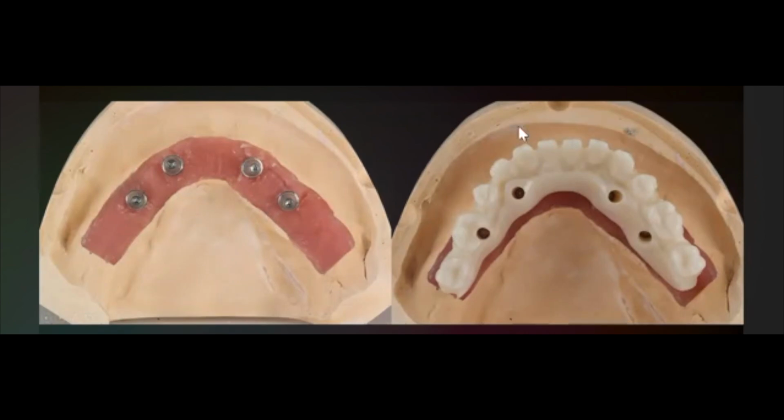So when I designed the case, I saw that it was a big framework. To cast this framework with gold palladium has to be very expensive, heavy, and of course with maybe some distortion of the cast and maybe some porosities from the shrinkage of the ceramic. So I asked them, can we make it with zirconia? And they said, okay, do it with zirconia, no problem for us.